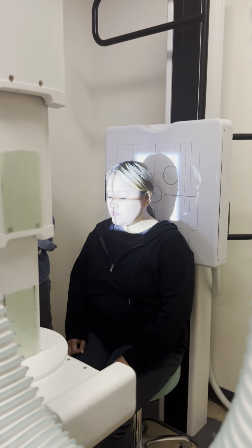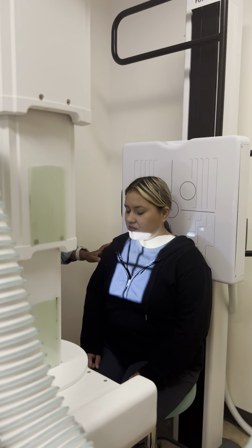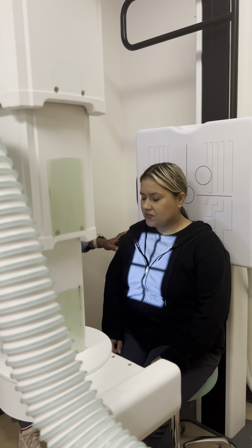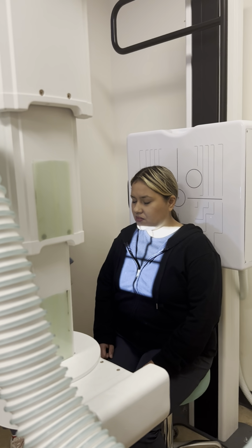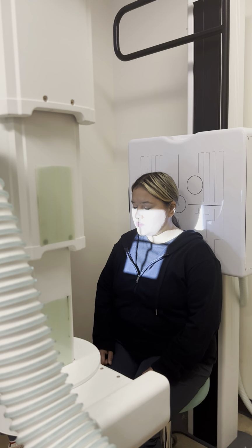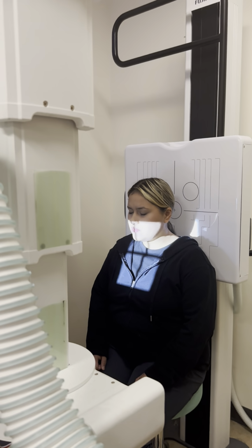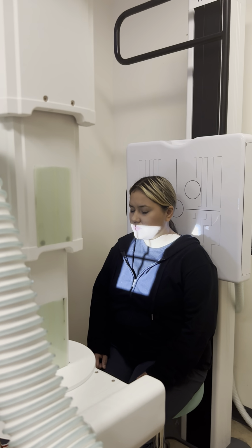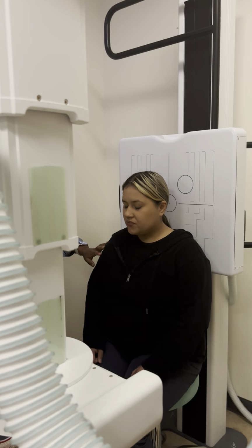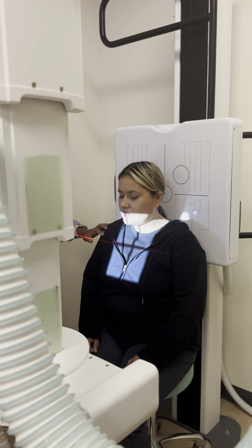So from here, let's continue with the AP, 15 degrees angulation. 15 is... no, we need to go the other direction. That's 15 from 90, so 75. Yeah, thank you, that's much more clear. There we go. Same thing, we're going to exit the same place. So 75 degrees.